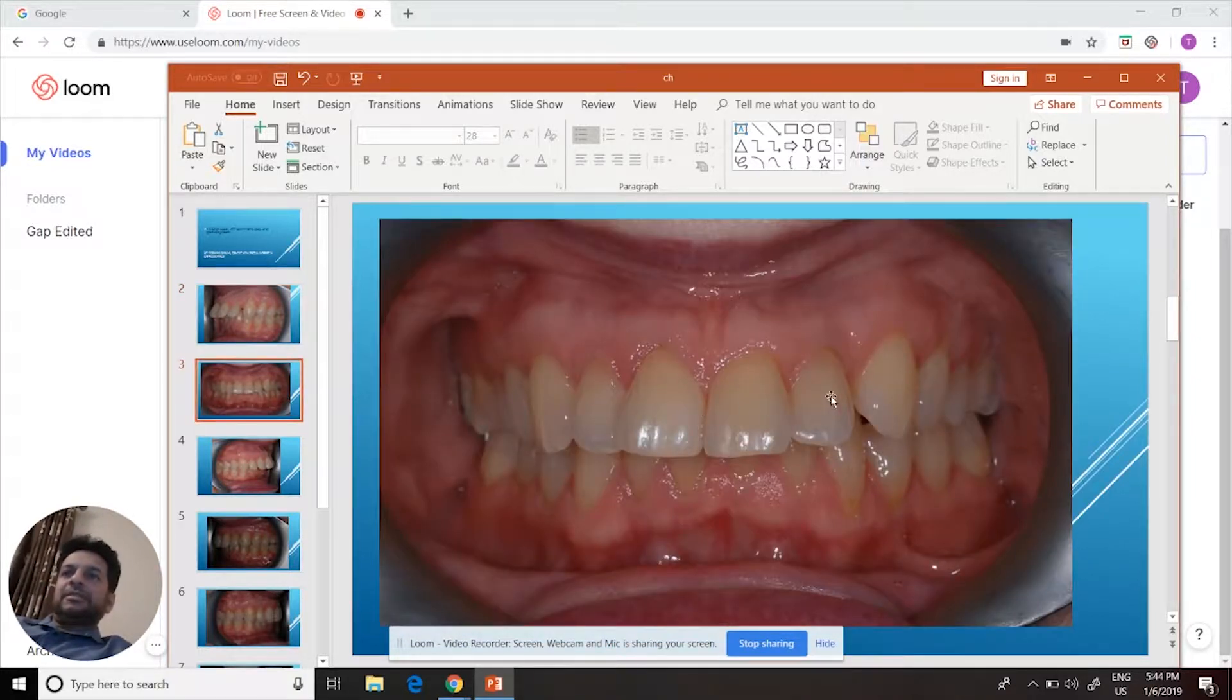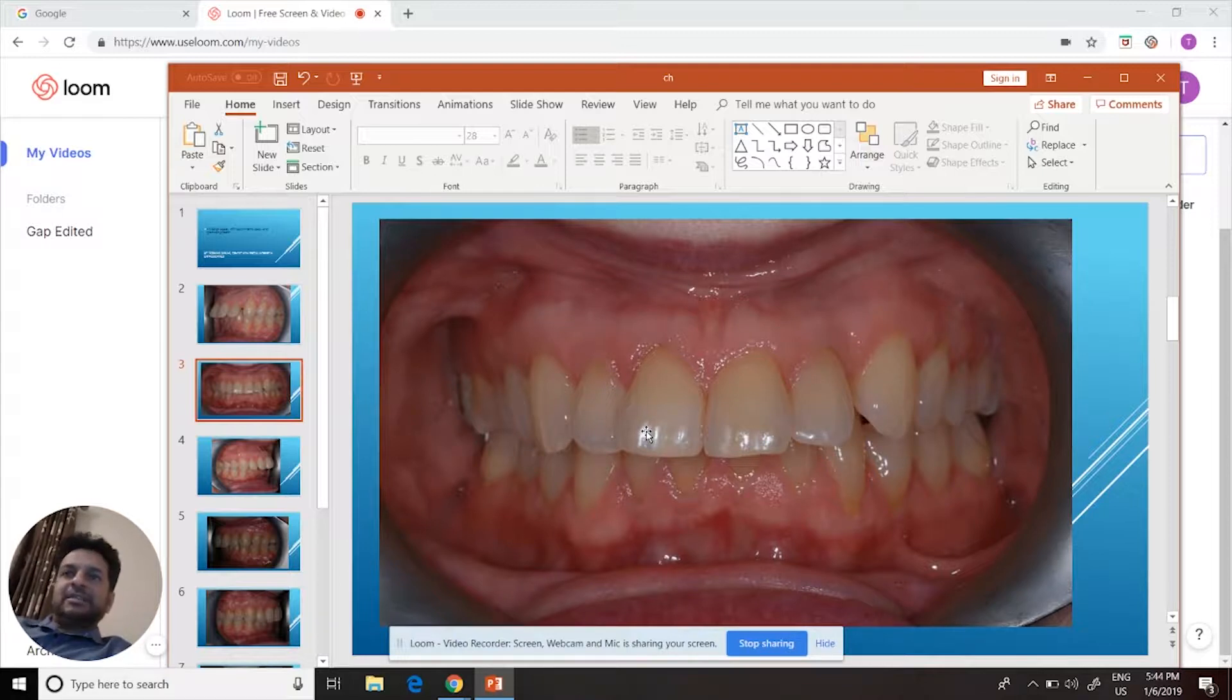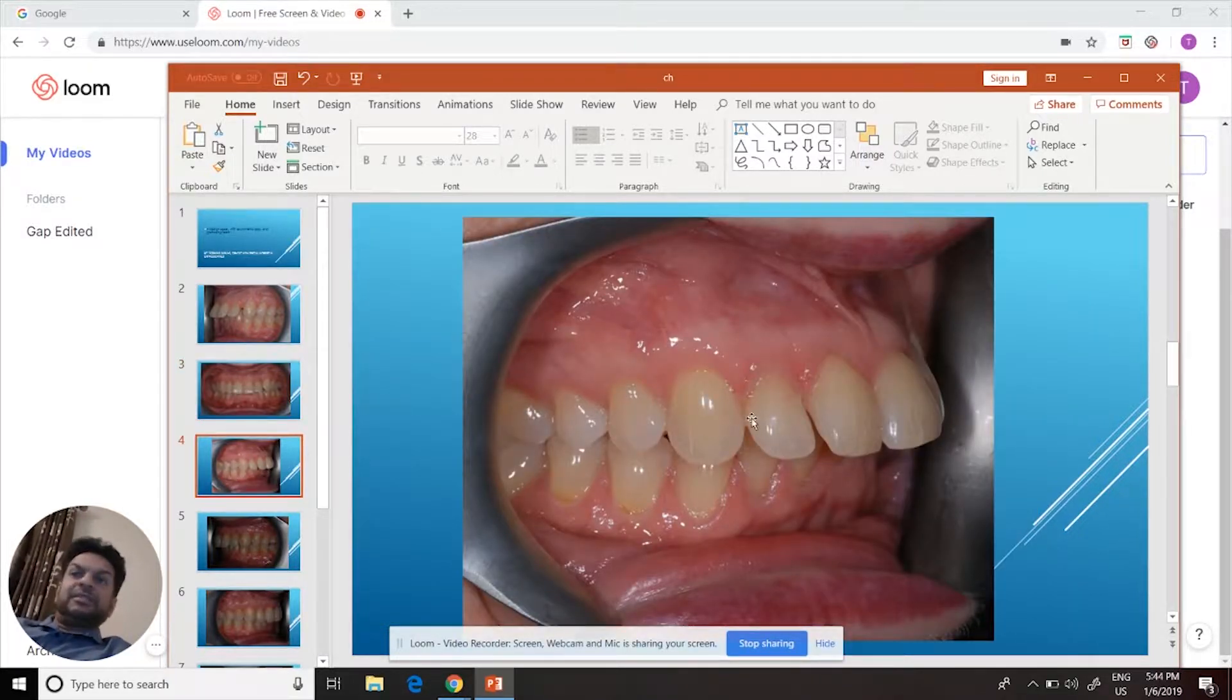So the gap is here, the teeth are sticking out. Here's the right side - see there's no gap there.